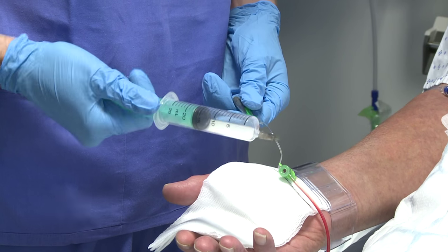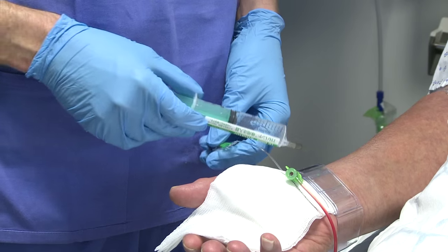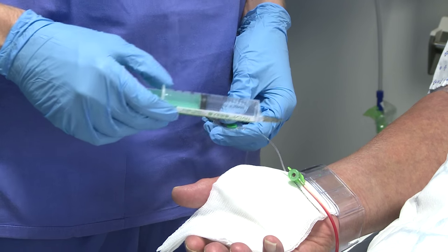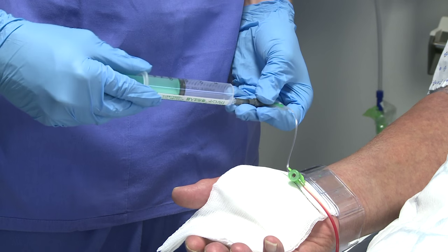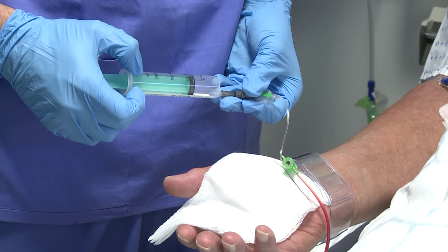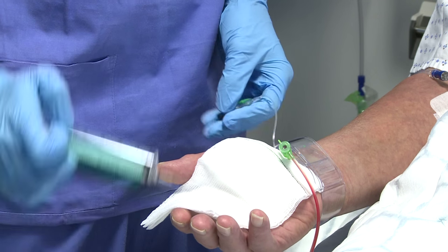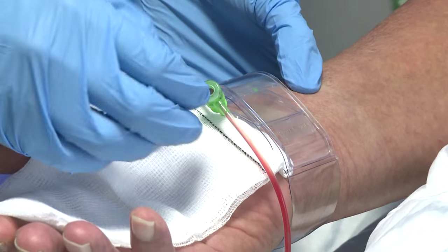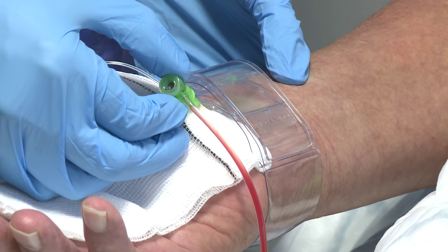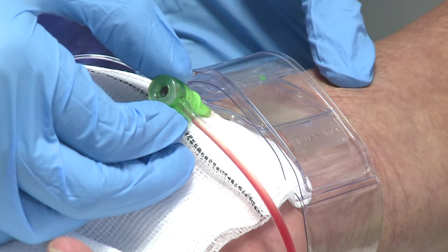As standard we tend to inflate the cuff to 15 mils. The cuff can take between 13 and 18 mils but we tend to inflate to 15 as a routine, so you'll just feel the cuff inflate on the wrist. You'll note there's a white gauze under here just to maintain cleanliness under the TR band. And here we'll just very gradually with minor traction withdraw the sheath.